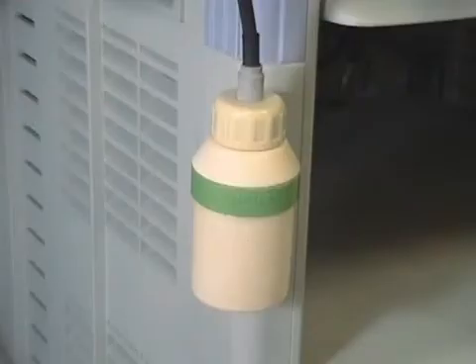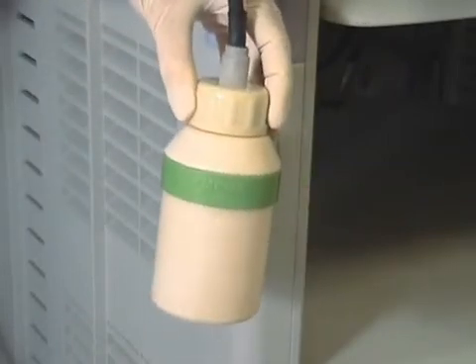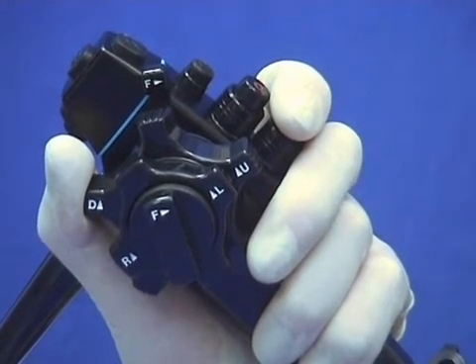If all else fails, as an emergency measure, emptying the water bottle of water and using full pressure on the water button will then insufflate air successfully down the water channel.